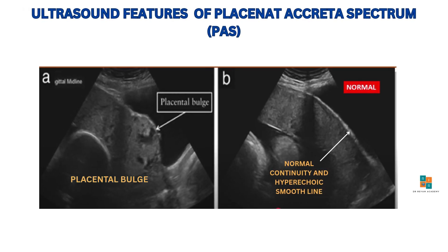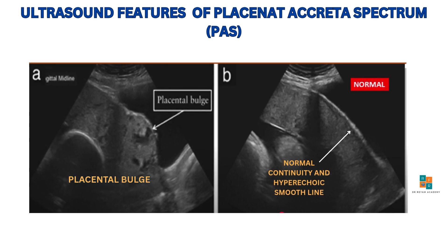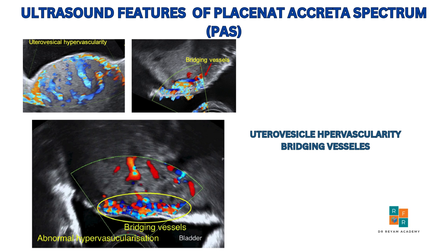In this image, we can see another feature of accreta, which is abnormal bulging of the placenta extending toward the bladder, in contrast to the normal smooth hyperechoic line typically seen with normal placental implantation. Because of abnormal angiogenesis that occurs in placenta accreta spectrum, color Doppler may reveal utero-vesical hypervascularity, which represents unusually high blood flow between the uterus and the bladder. Another important feature is the presence of bridging vessels — abnormal blood vessels running from the placenta across the myometrium and serosa toward the bladder, often oriented perpendicularly to the myometrium.